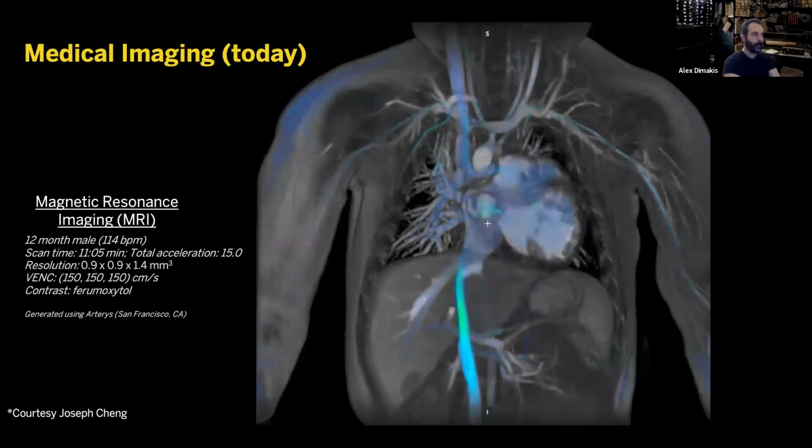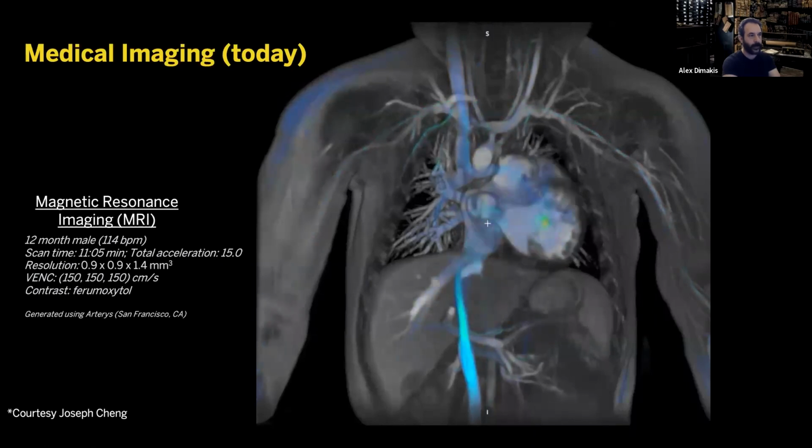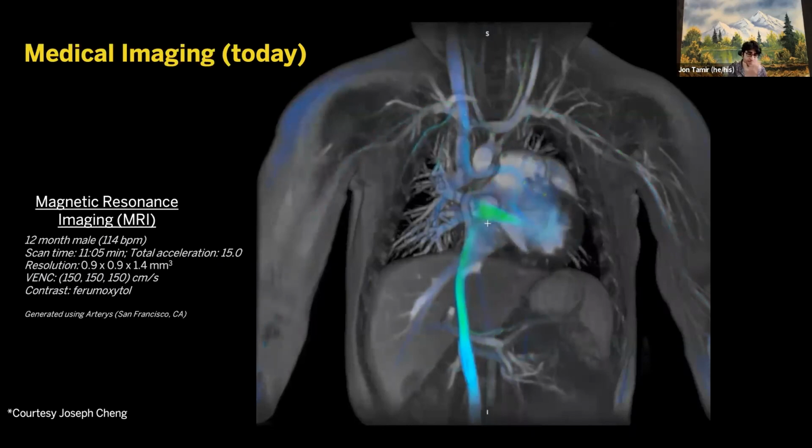Yeah. And John, another kind of related thing is to the computational bottlenecks. I know FastMRI is quite low resolution in the 300 by 300 pixel range, right? So are these diagnostically useful images, or do the diagnostically useful ones have to be 1000 by 1000 or higher res? No, actually in MR, that's pretty typical.